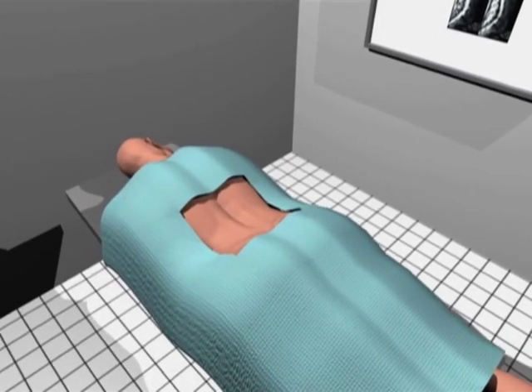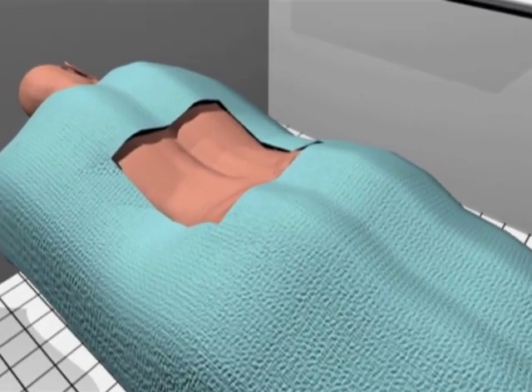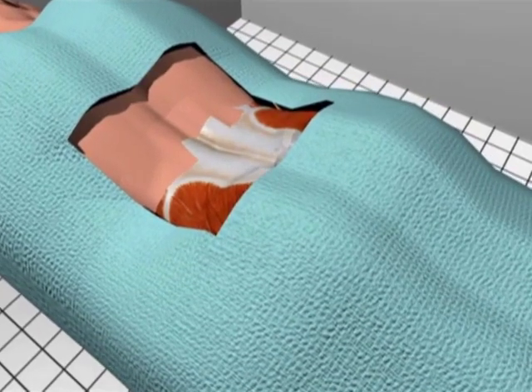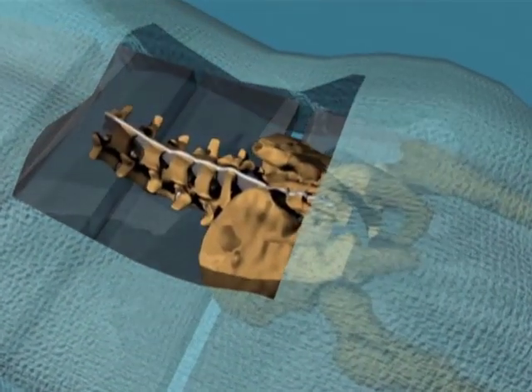Position the patient in the prone position on the operating table. Identify the spinous process of the level to be instrumented using palpation and intraoperative imaging. Make a midline incision about 3 centimeters in length, exposing the spinous processes at the correct level.